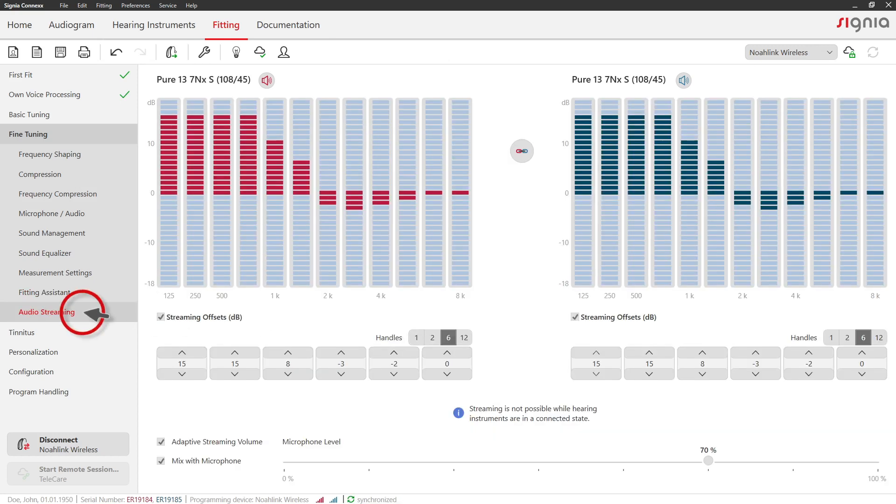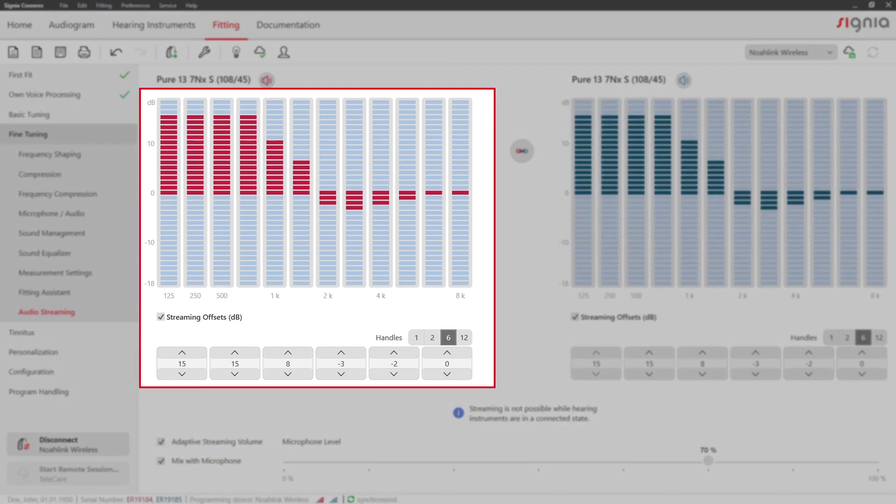In the Audio Streaming tab, you can adjust the sound quality during Bluetooth streaming. The streaming offsets describe the differences in gain during streaming in comparison to the hearing aids gained during regular use.